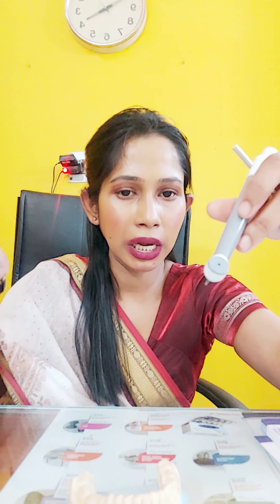The cheek we are stabilizing. Between the tongue and the air rotor, we will put the mirror. But the mirror's shiny glass part should not be put against the diamond bur — otherwise, with the course of crown reduction, you may end up reducing the glass surface of your mouth mirror. And if that glass particle goes inside the mouth, it can be hazardous.